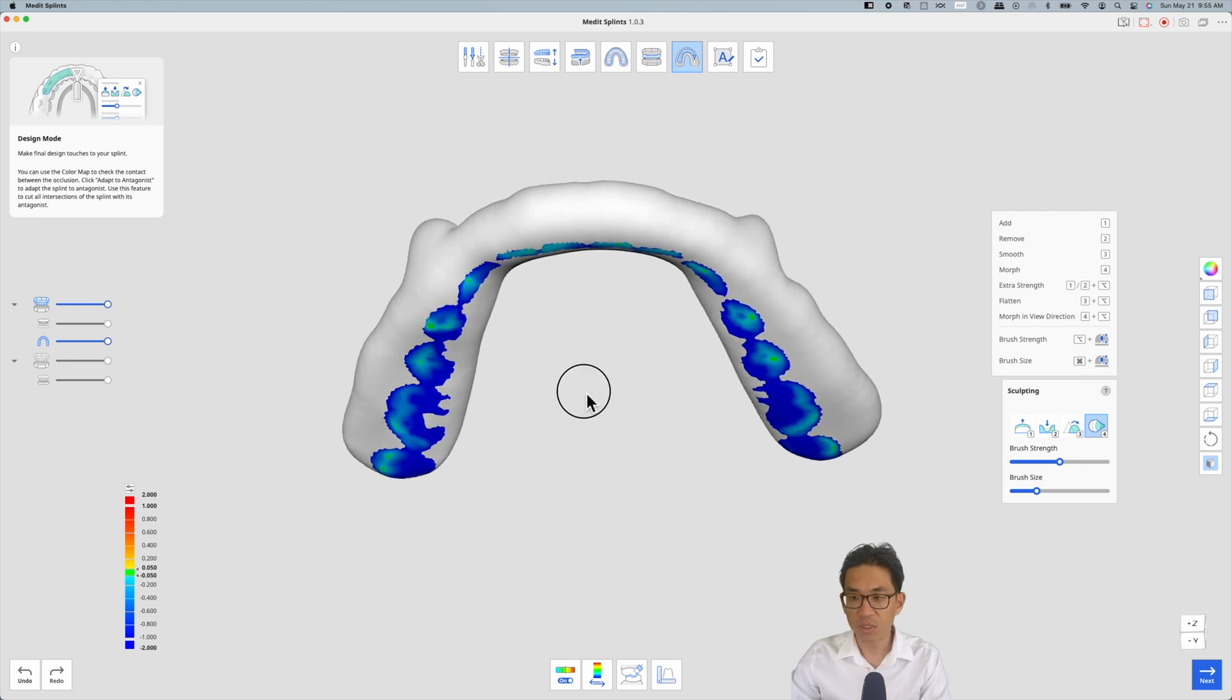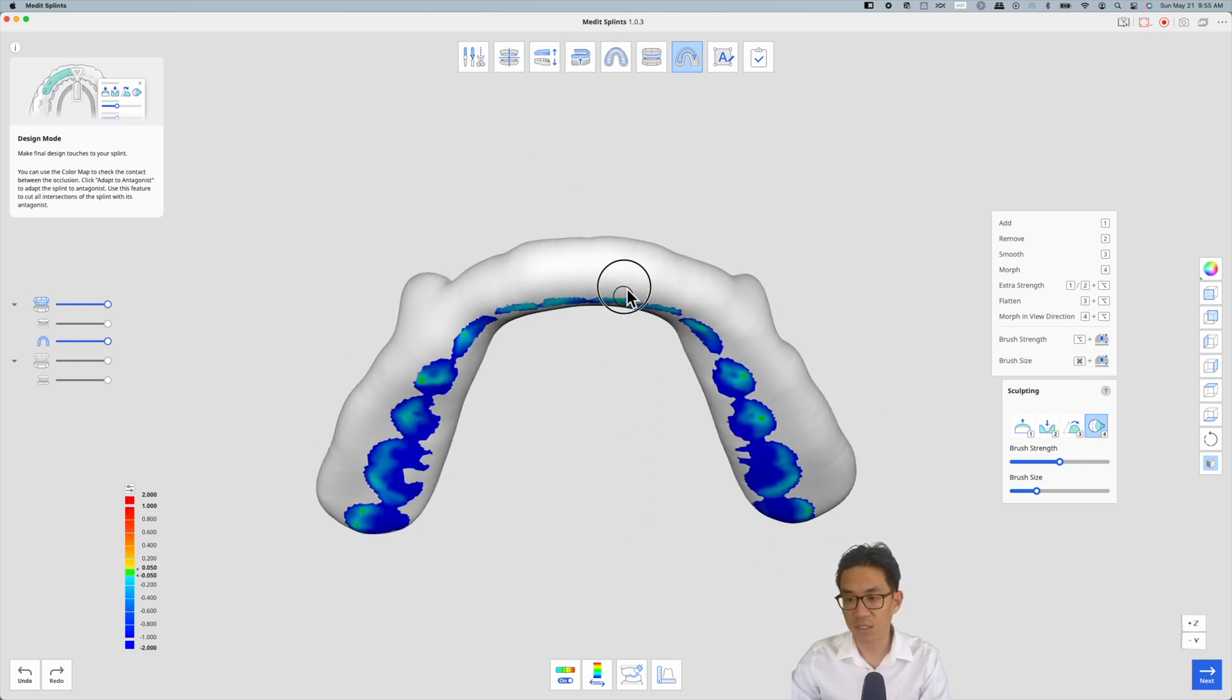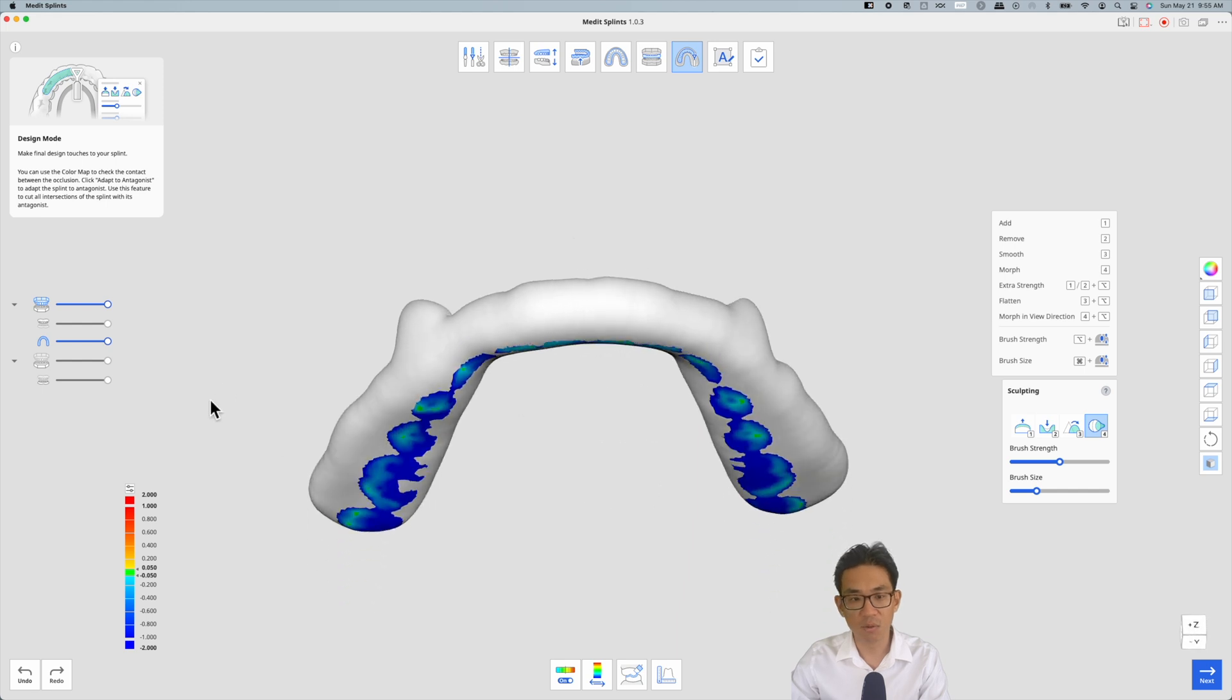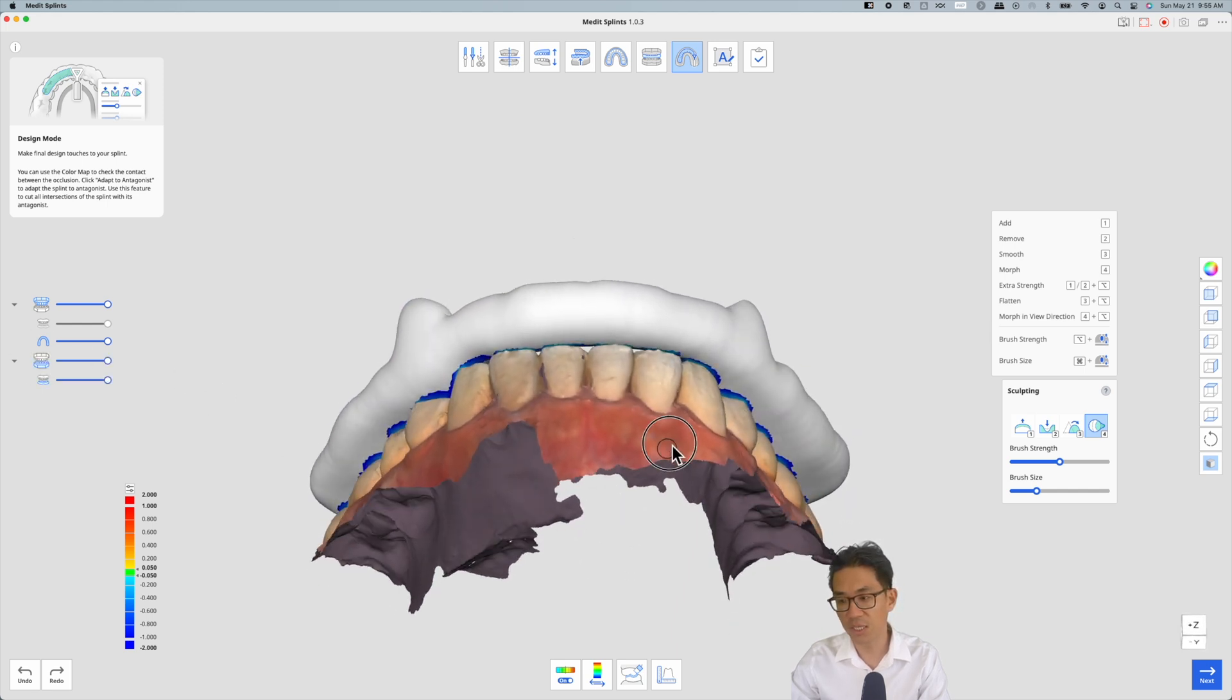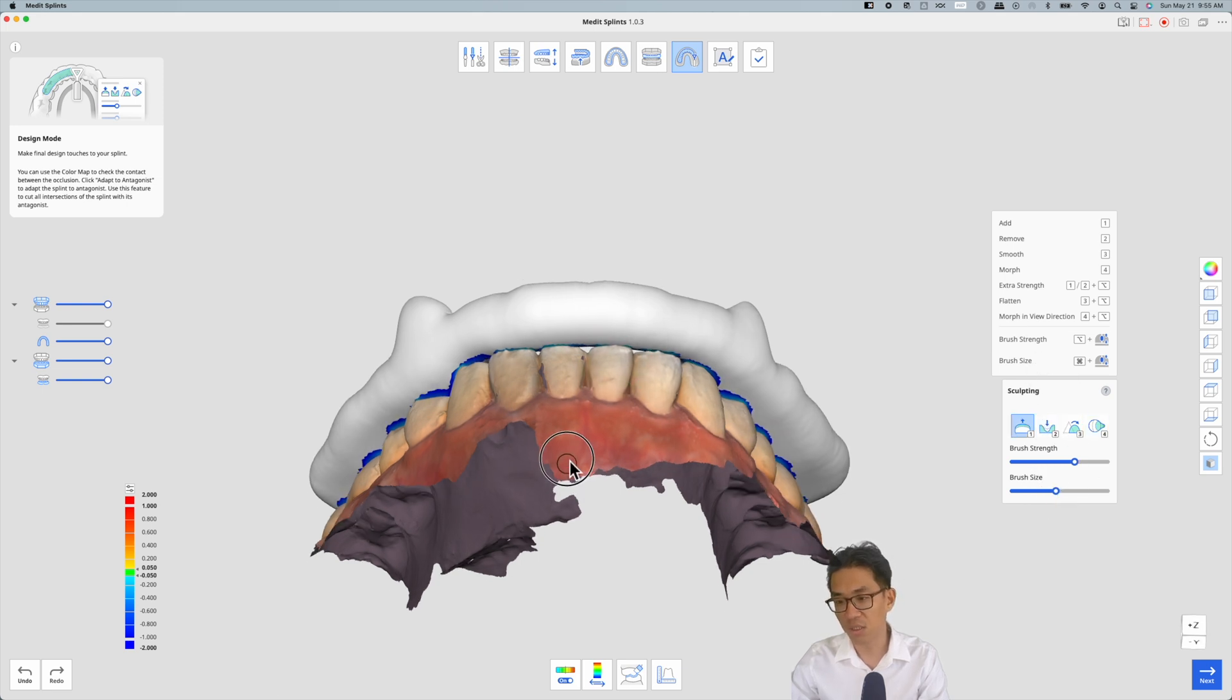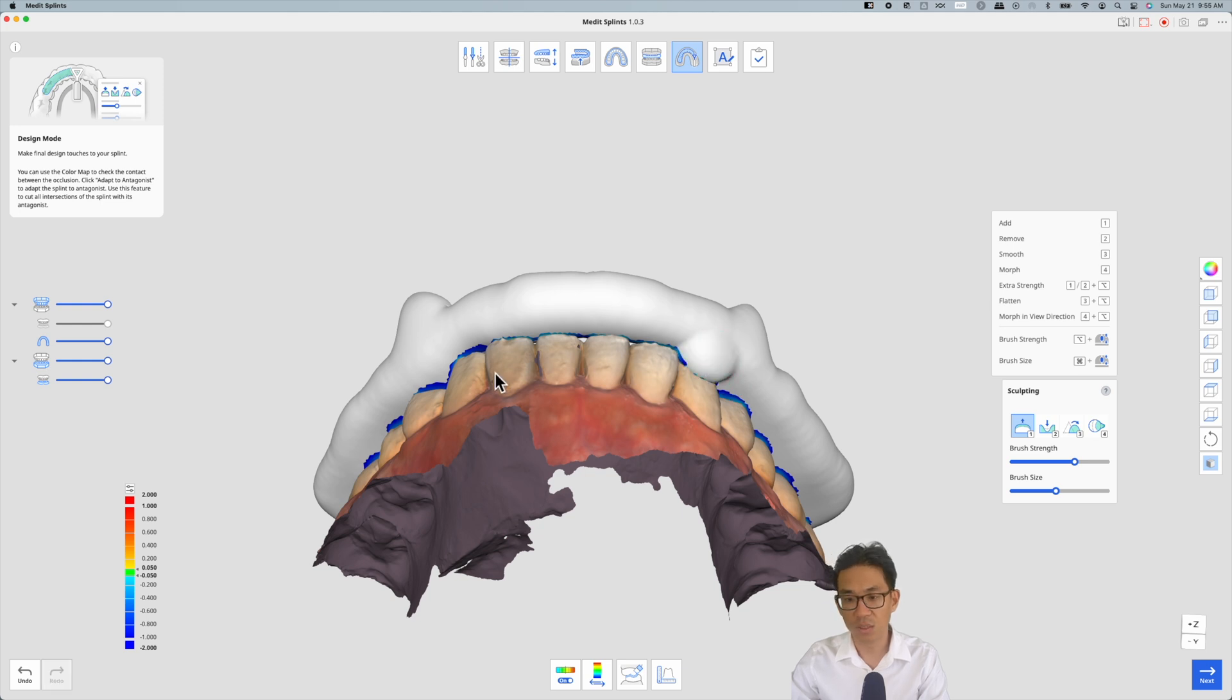If I would like to add a canine rise to the splint, I will show my lower teeth and hit one brush, make brush size here, and then I can add material at this canine area and as well as here as you can see.